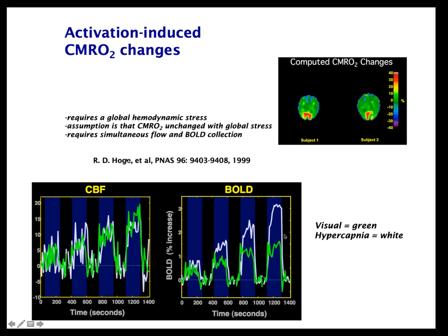And so the difference between those two points gives you maps of CMRO2 change, which is great. So it's nice if you really want quantitative changes in oxidative metabolic rate with activation. However, as you can see from this experiment, it's really cumbersome. And since you're dividing two things, once again, the signal-to-noise is really low. And once again, because it's perfusion, it's only limited to a couple of planes. So it's really hard to do. Nobody does it. Nobody really needs this quantitative information that much.